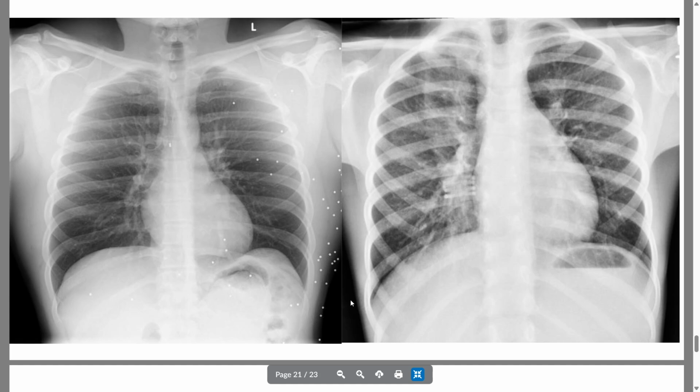On the left, we have somebody who was actually shot. So all of those metallic fragments are from a shotgun, I believe. But similar things you can see with BBs, if those were to happen. They're pretty focused in a general area and have spread out from there.